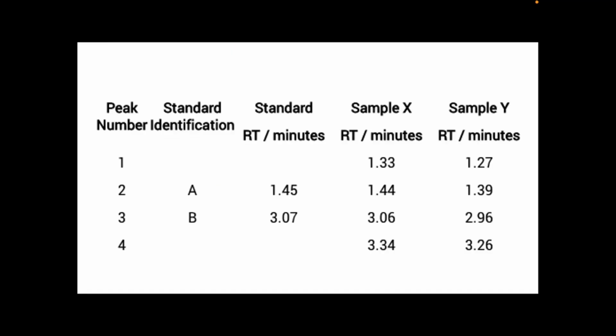This illustration here shows the different retention times for the different analytes. As I have mentioned, qualitative analysis usually relies on comparing the retention times of the peaks in an unknown sample with those of the known standards. If the retention time of a peak in an unknown sample is the same as the standard, then positive identification can be made. Just like this one.